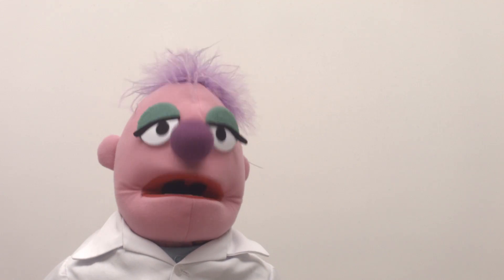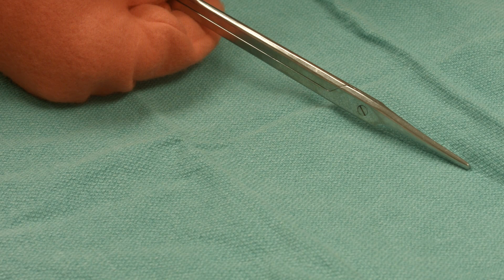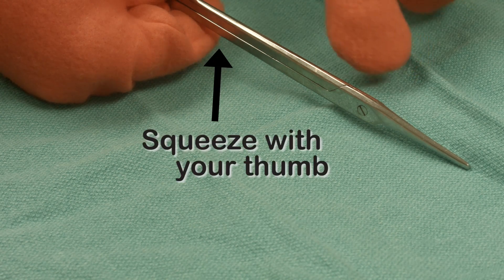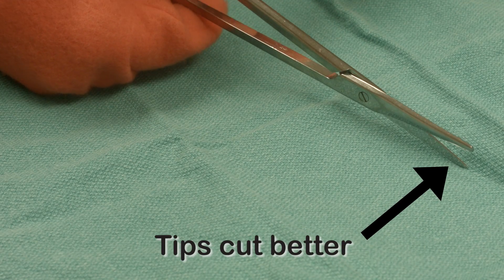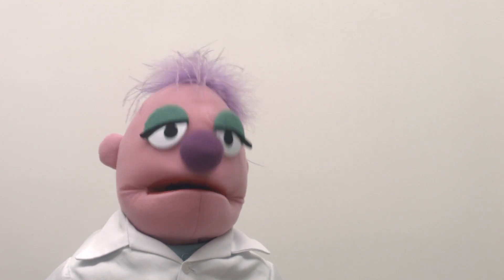But why didn't my scissors work in the OR? It might be this. You can make the straight scissors work if you use the fulcrum — just push with your thumb a little, and that will make the blades come together better at the tip and cut really nicely. Snip! That's a great tip!